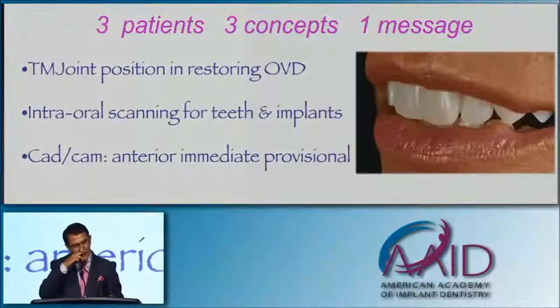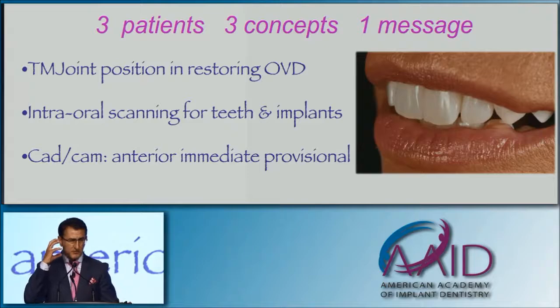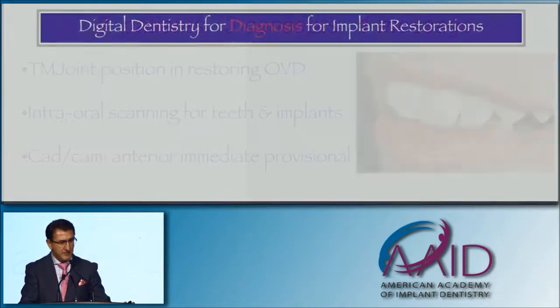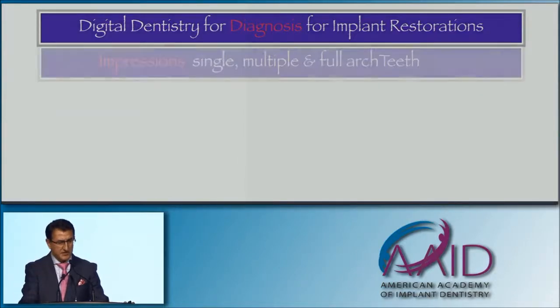So we're going to talk about 3 patients, 3 concepts, and 1 message: the TMJ, restoring over occlusal vertical dimension, intra-oral scanning with teeth and implants, and then CAD/CAM anterior immediate provisional. Again, we're using digital technology for diagnosis.